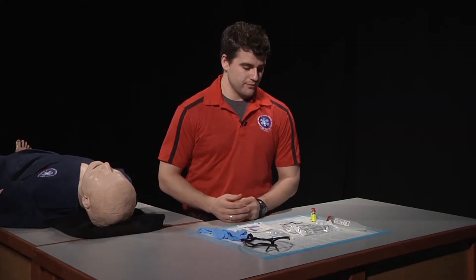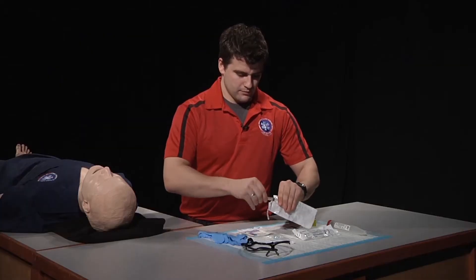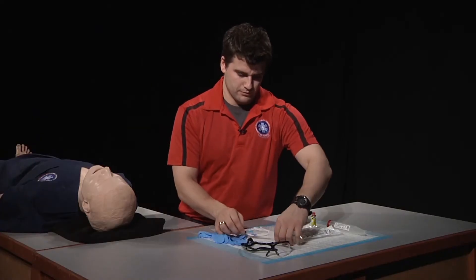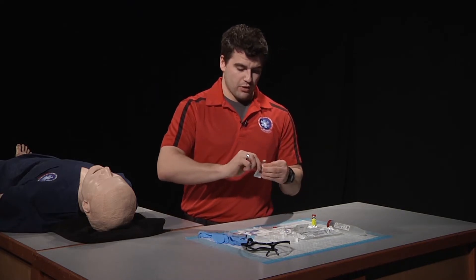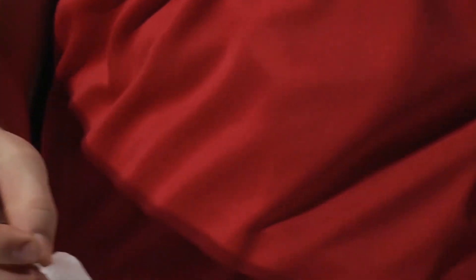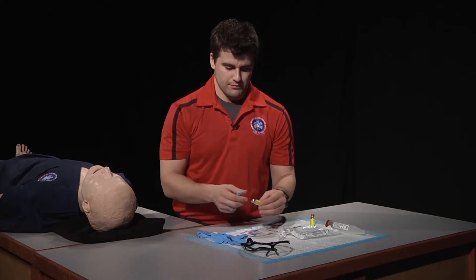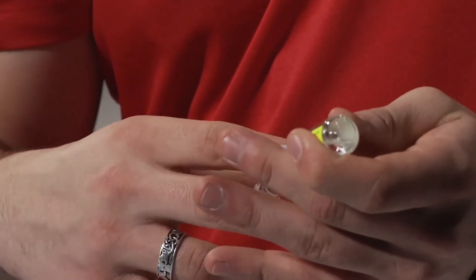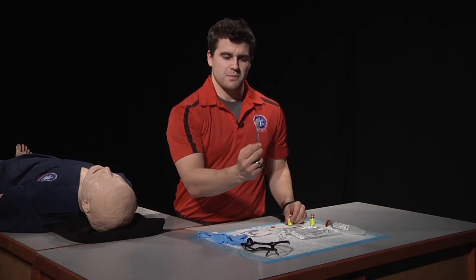Now it's time for us to draw up our medication. We're going to remove the syringe from the packaging and attach it to our needle. From there, we're going to grab our medication, remove the cap, and clean the rubber stopper with an alcohol swab. Once that's been cleaned, we're going to draw up our medication. Once we've drawn up the appropriate amount, we will dispel the air from the syringe.